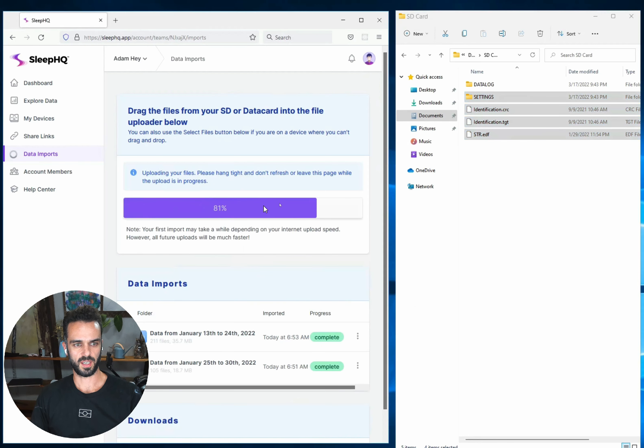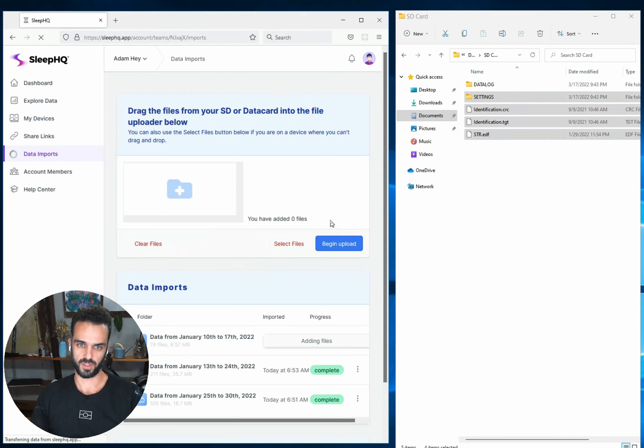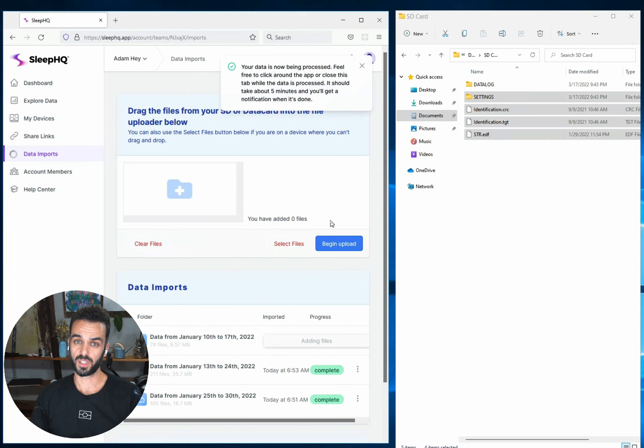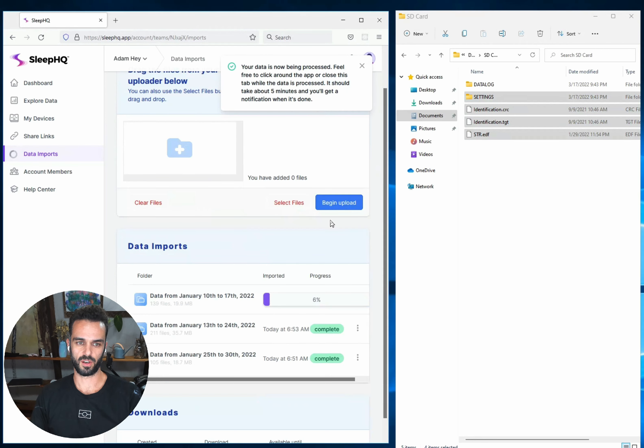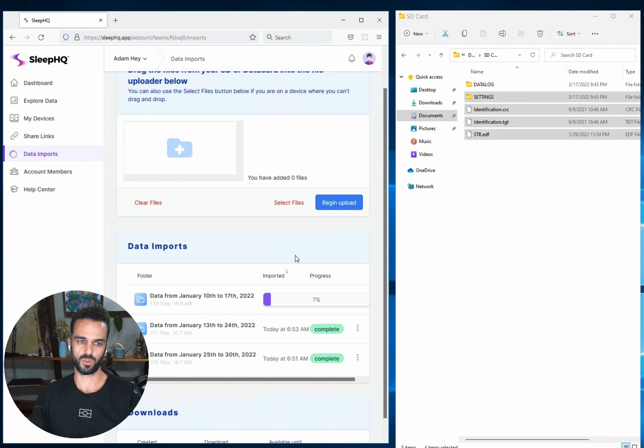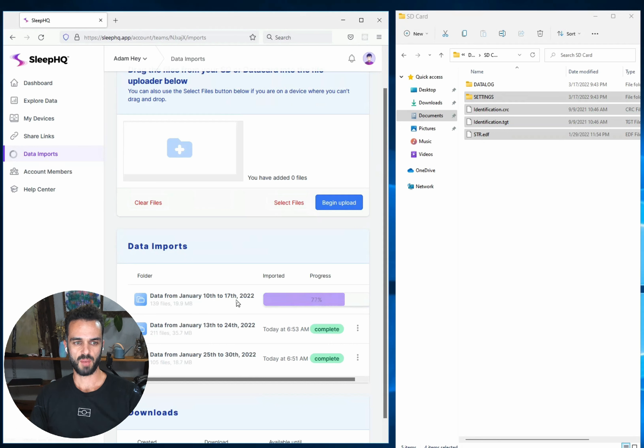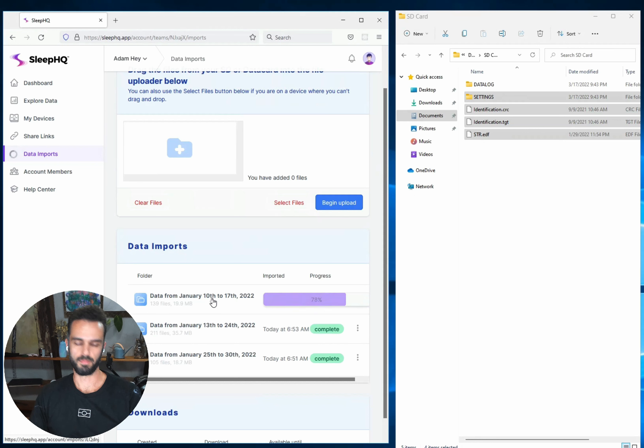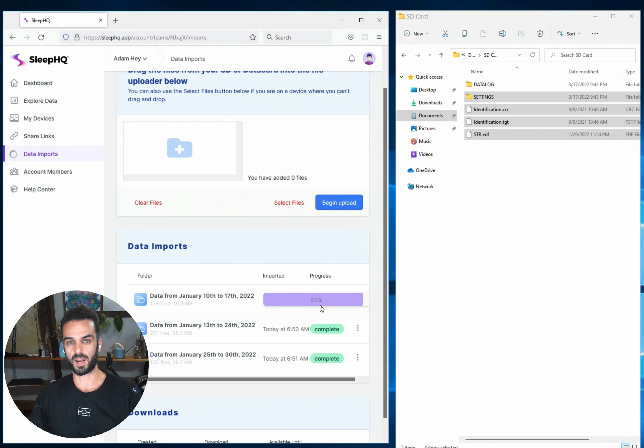Now what you'll see happened there is it jumped straight up to 80% because it had already uploaded most of those files. So it was really quick to do that. It hasn't actually duplicated those files on the system. They're only stored once. It's showing that I'm uploading the data from the 10th to the 17th of January, but really we're only processing the missing days effectively from the 10th to the 12th because everything from the 13th onwards was already processed. So that upload should be really quick.